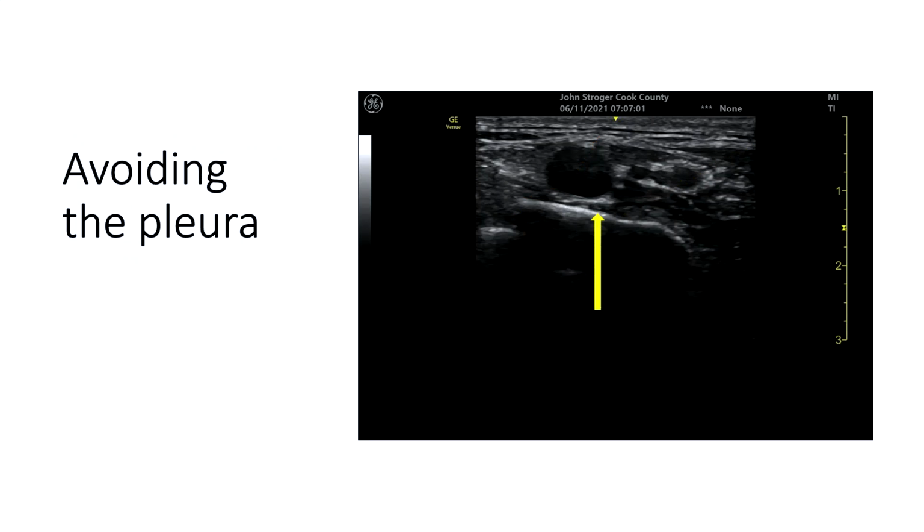However, if you started with a rib, and I should have an actual image of that, but anyhow, imagine the rib is, instead of starting there, starting here and then extending lateral. Notice that it looks solid, it looks the same, looks like you will drive the needle toward the same rib, and it won't make a difference. But it does, because this rib will recede toward you, so if your needle just drifted a little bit back, it could be in the pleura without you noticing, because you will be seeing an image that is more anterior.